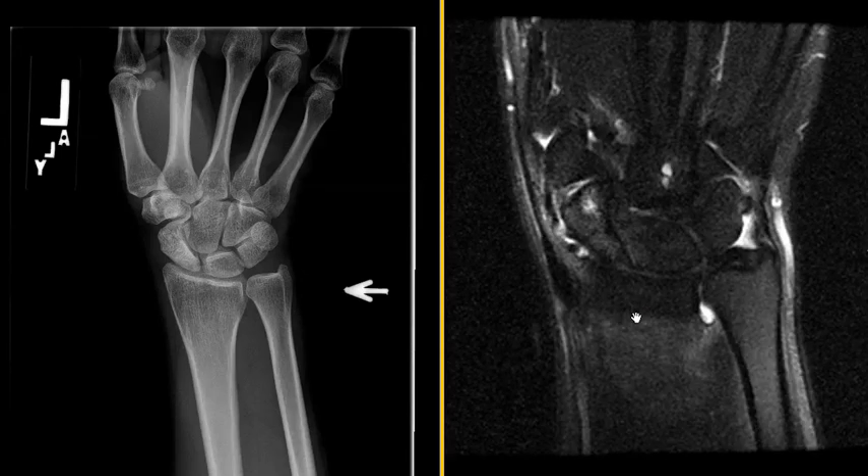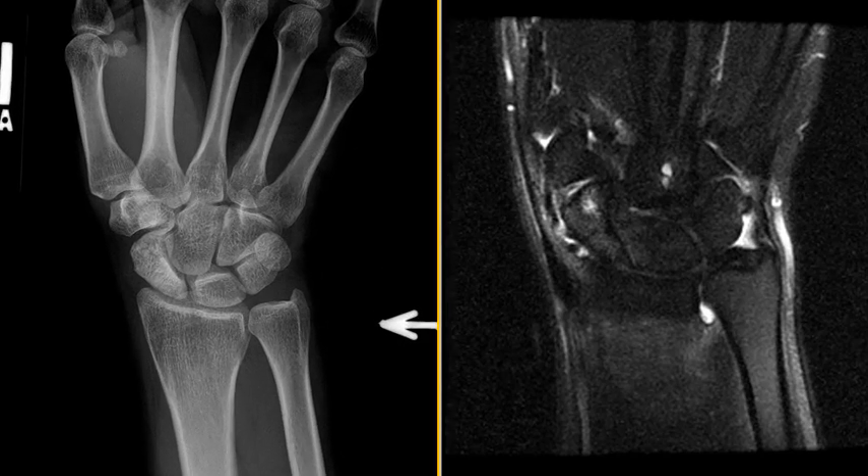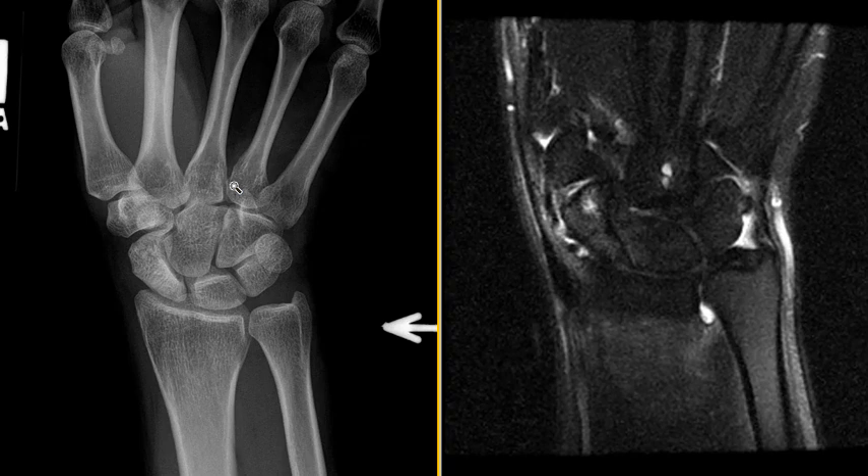Hello, this is Dr. Gay from First Psych MRI, and this is a 40-year-old female who injured her wrist several months ago. The pain didn't go away, so she finally went to her orthopedic surgeon, and he ordered some x-rays to see if there was a fracture. There was no evidence of a definite acute fracture, but there was abnormal increased density in this bone.